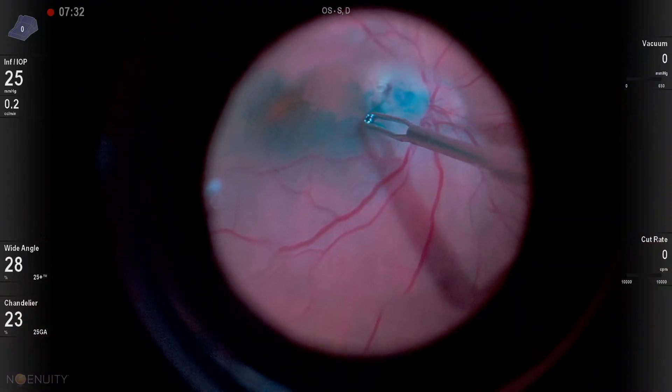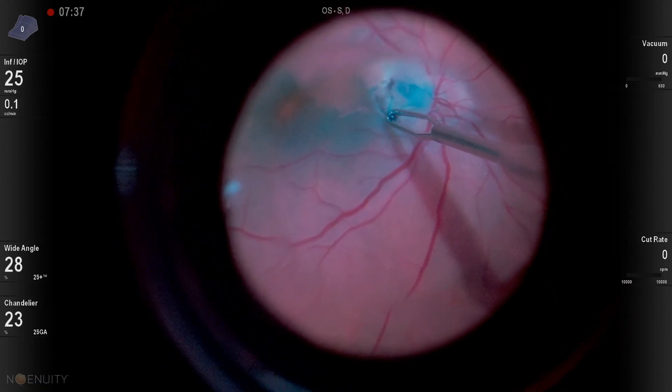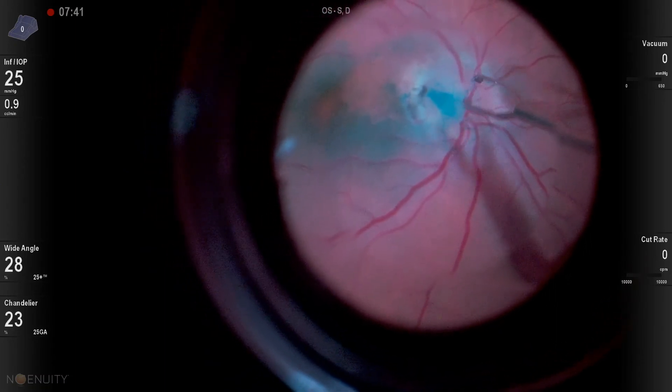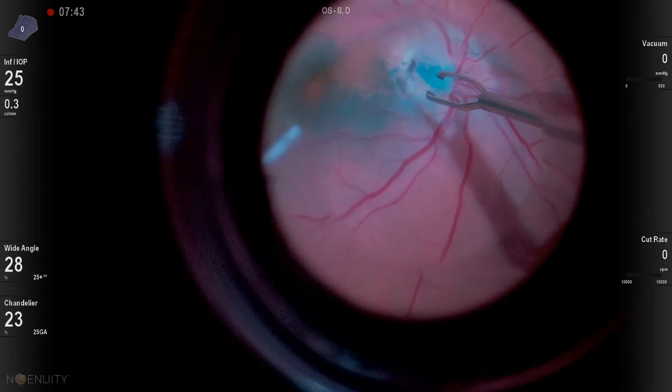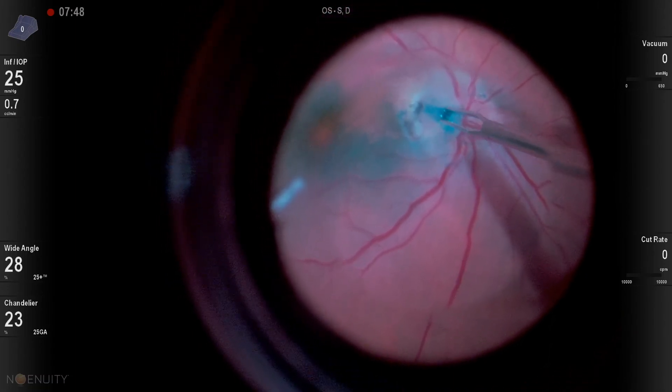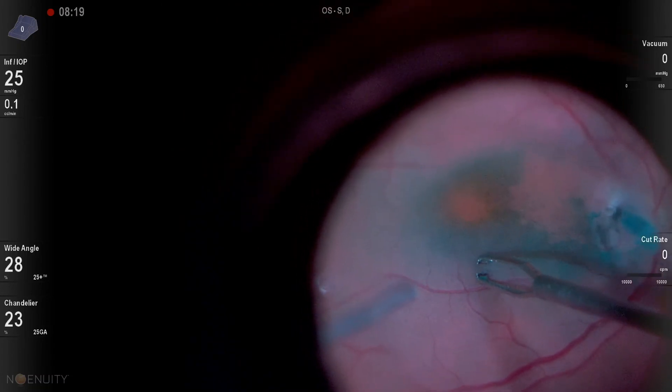Now, after staining, that ICG did penetrate and stain the ILM nicely. There was this tissue by the disc pit, and so I tried to peel that, and it was really fruitless. You just couldn't get a good grasp. It looked like it was maybe residual vitreous that had been incarcerated into the pit. But this really wasn't a great place to start the peel.